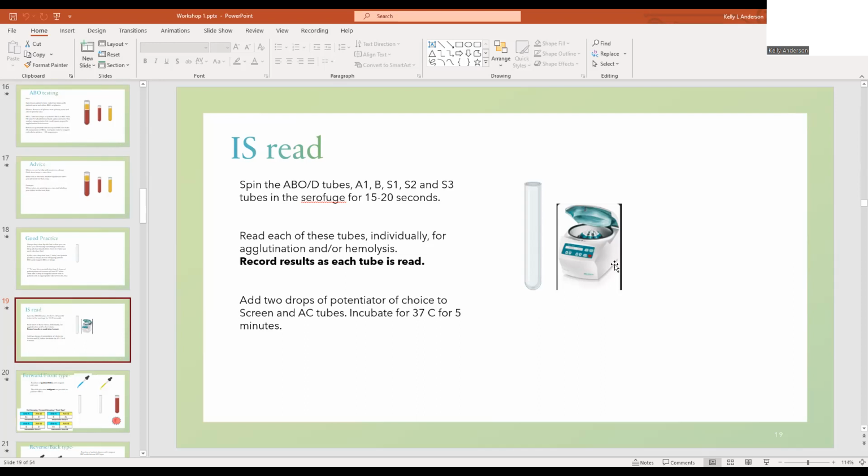So it's just the plasma and the red blood cells, right? I had plasma and I added red blood cells, so that's all I added. But there's no reagent, right? The screens are being passed around, so you don't have them yet. I meant the auto control, it's just the plasma and the red blood cells. You're just testing for autoantibodies, so you don't have another reagent.